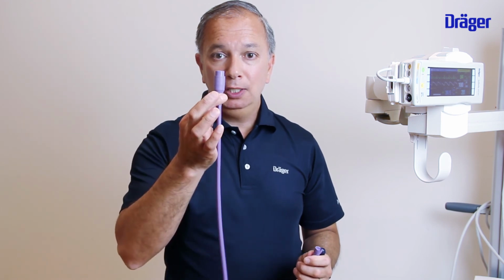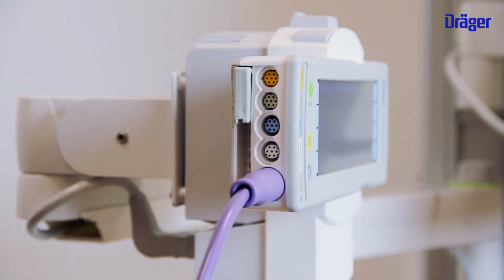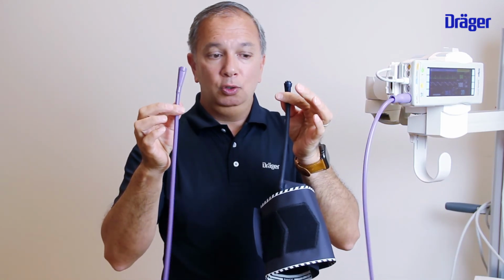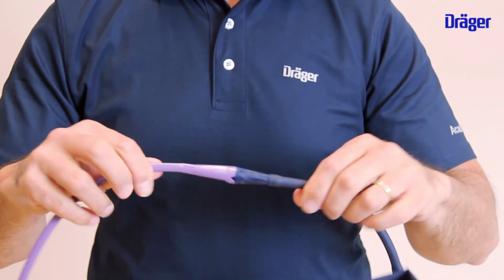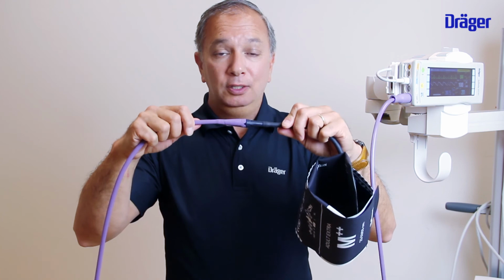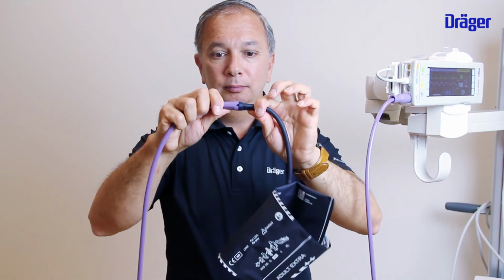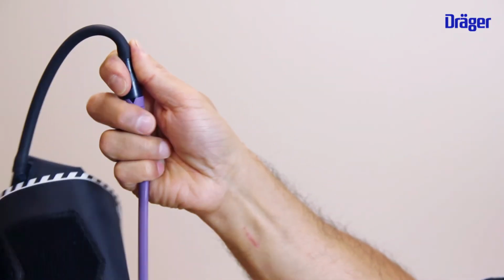To connect your NIBP hose to the monitor, you take the NIBP hose and connect it to the NIBP connector on the bottom of the M540. To connect your cuff to the hose, you just click it, that's it. To disconnect the cuff from the hose, don't pull, just snap. You can also snap it with one hand.